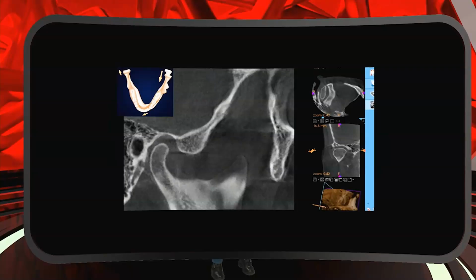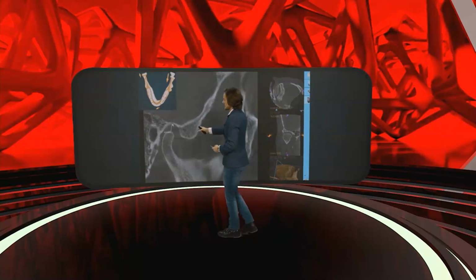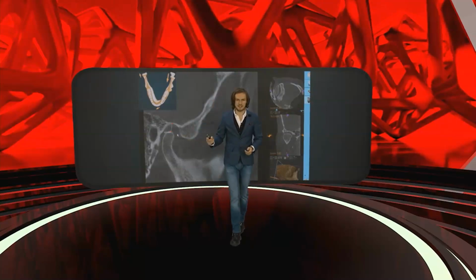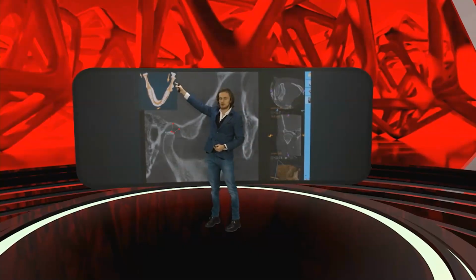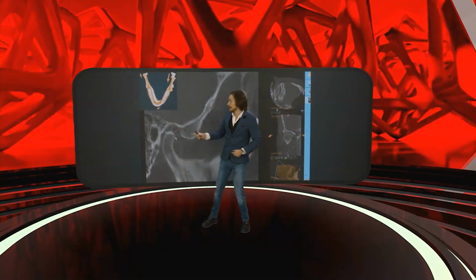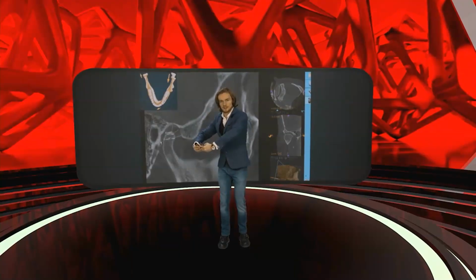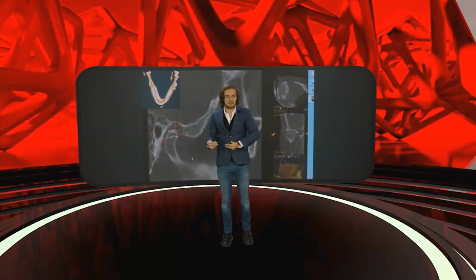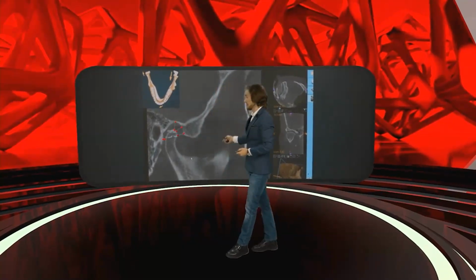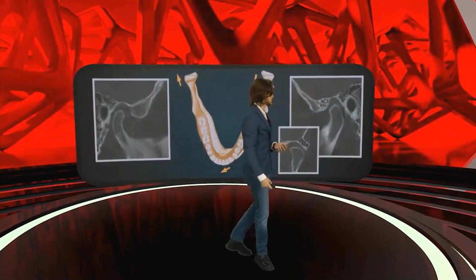You see this? This is another joint of this patient, so we see that another one is distalized. So you think straight away, all right, this one, the lateral pole, is too much laterally, and this one looks this way, so we know that the mandible is rotated, and this condyle is distalized, and in here the lateral pole sticks too much outside, right? So this is how it looks like, and you see it on the pictures.